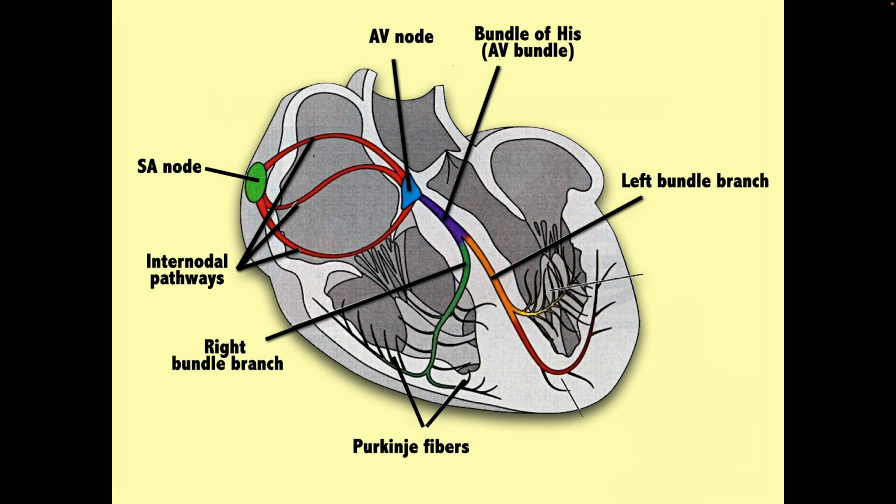So, okay. Most of the time, a sinus rhythm will be narrow. But suppose the sinus node fires off, the impulse races down to the AV node, there's a pause, it goes into the ventricles, and suppose there's something wrong with the speedy conduction system.